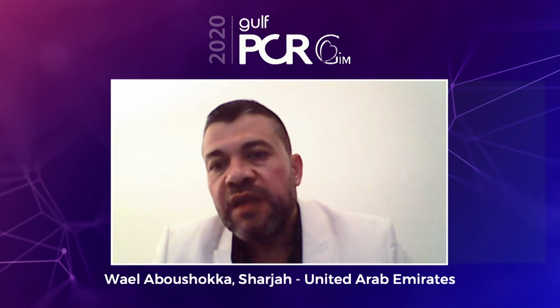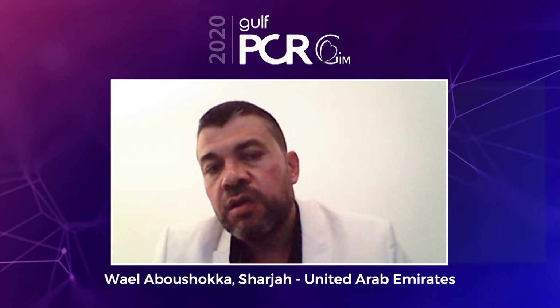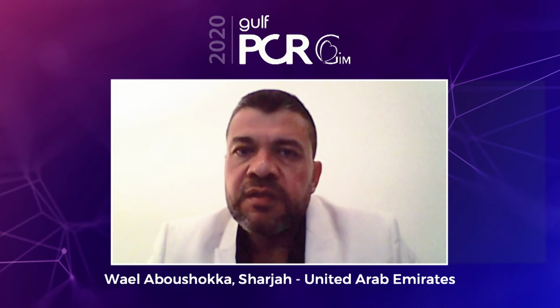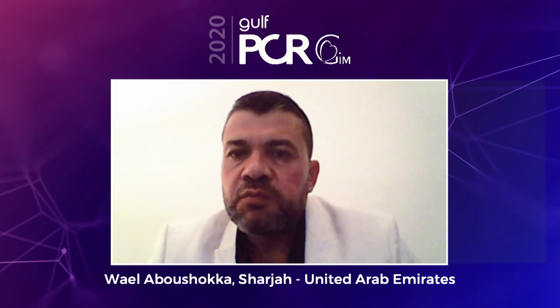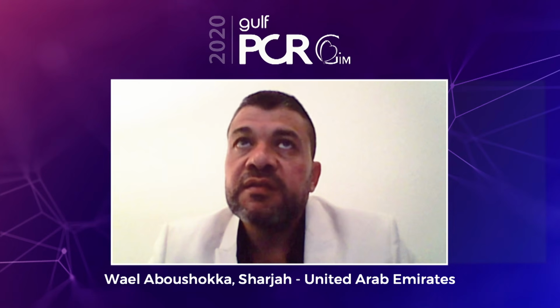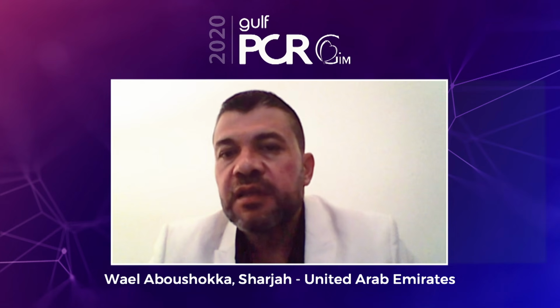Actually, in left main cases, especially, and where you need a very big diameter, the CSI orbital atherectomy gives you a very good choice. Although the shockwave also has big diameters, still our experience is more with atherectomy devices.